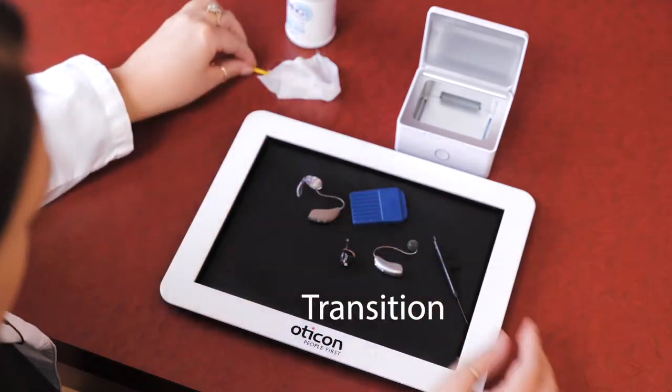Occasionally, domes and wax guards will need to be changed. If you see earwax or notice a change in sound quality, try changing those to see if it makes a difference. You may think your hearing aids are no longer working or that your hearing has changed, when all your hearing aids needed was a little TLC. The time between these changings will vary based on the individuality of each patient. If you need more wax guards and domes, your healthcare provider will be able to help you with that.